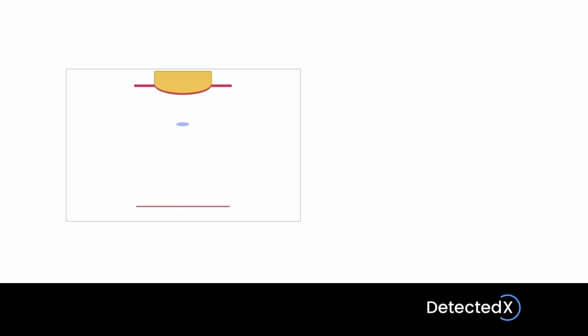So this pulse travels at a constant speed through the tissue, hits the tissue interface, and an echo returns to the probe. The remaining energy travels into deeper tissues where it can interact with them. This is obviously a simple diagram with only a single reflector, and I have very conveniently made it perpendicular to the beam so the echo does return to the probe.